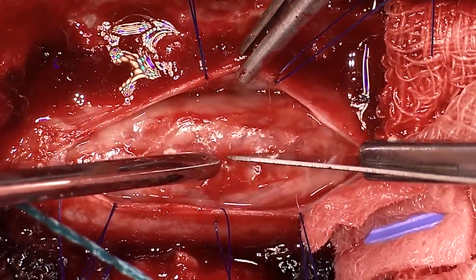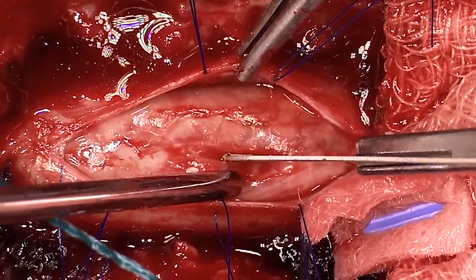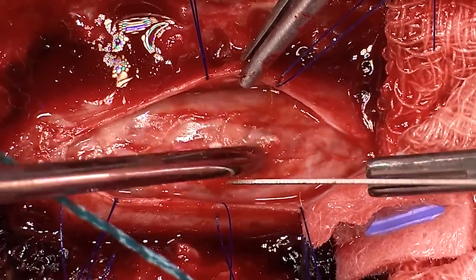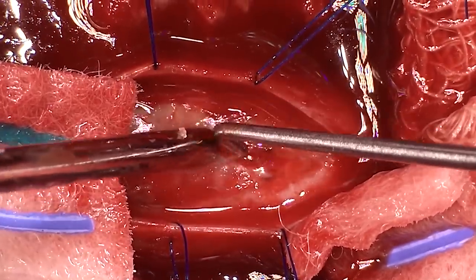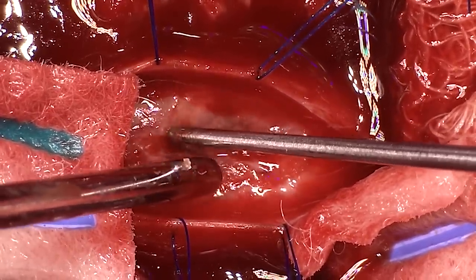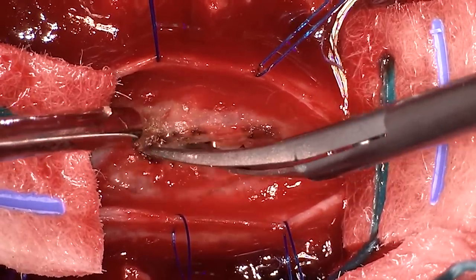So once we've done that we've got the spinal cord underneath. Remember it's quite damaged because there's a bullet lying in the middle of it that's come in with high velocity and caused a major amount of trauma here. We need to make a small cut bang in the middle of the spinal cord where we think the bullet is. With the sucker in the left hand we can feel that the bullet is a lump just underneath where we're making that cut. We're using a blunt hook again to just pry open this window we've made into the spinal cord and at this point we start to see a small glint of what might be the bullet. And there you can see it shining under the light of the exoscope.